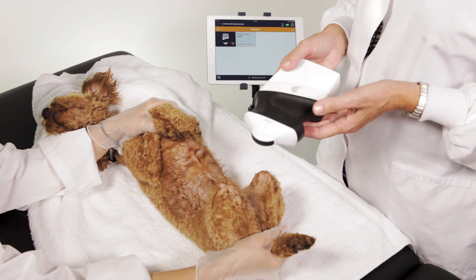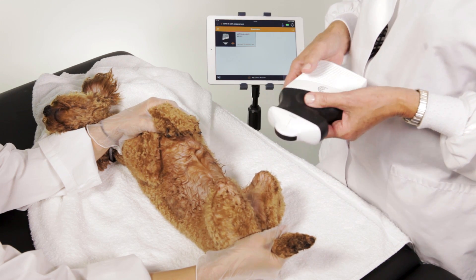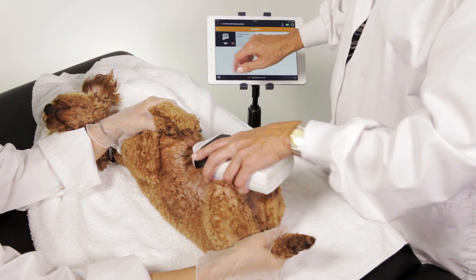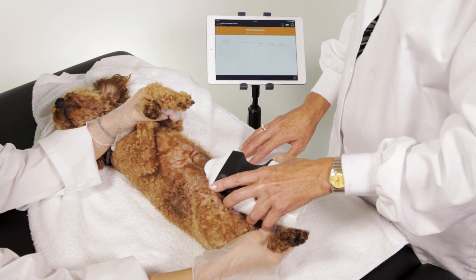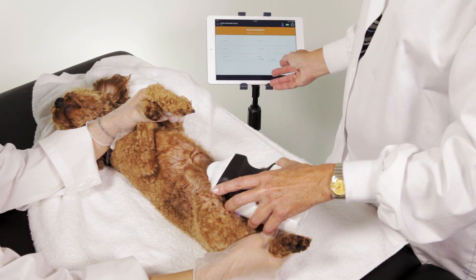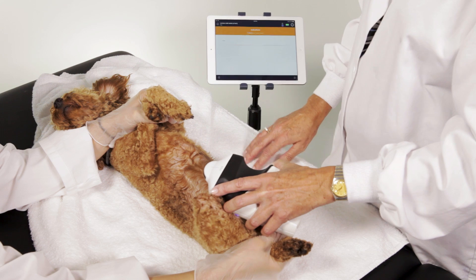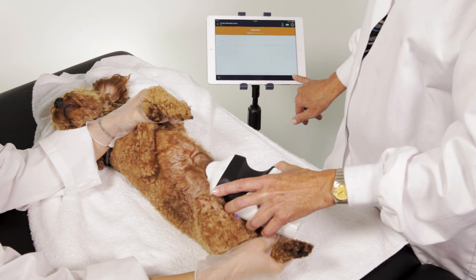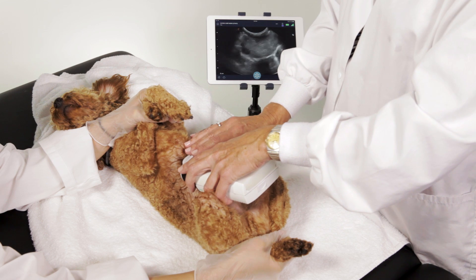We're going to hit four different spots on the animal looking for free fluid, which often can be blood after a traumatic event. First, I'm going to start with selecting the right scanner and the right application. You'll notice here we have where we can put information on our pet animal. We can also add notes as to what we know about the accident, any medications, or anything else we need.